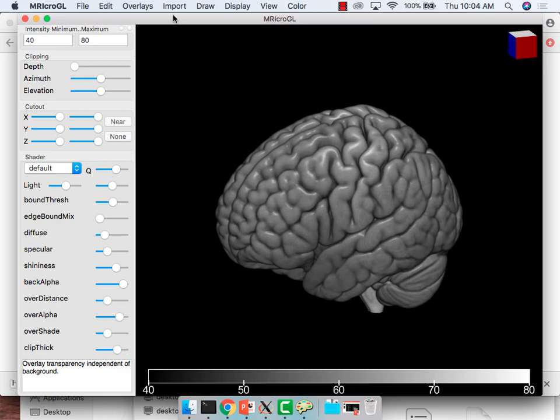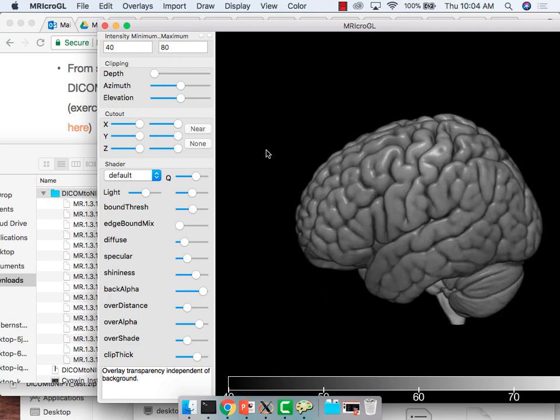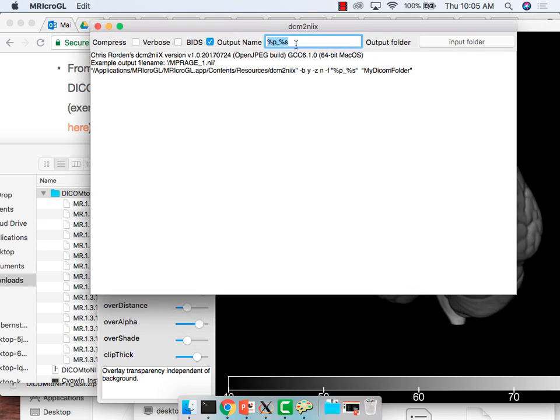But just to show you how easy this is, it's a pretty simple tool to use. Aside from the visualization part of it, you'll notice that they have this import option up here. You click on Convert DICOM to NIfTI. I have no idea what Convert Foreign to NIfTI is. That must be fun. And then it will output them in a certain format. If you hover over this, you can see what the different options are. It's using this string formatting procedure, which may be new to you, but basically if there's an ampersand or percentage sign and a letter, it replaces that with a variable, with some field.